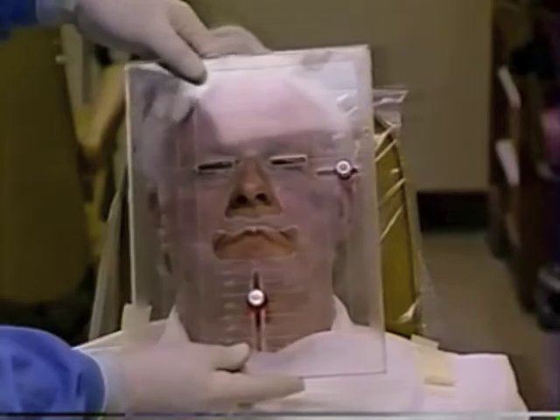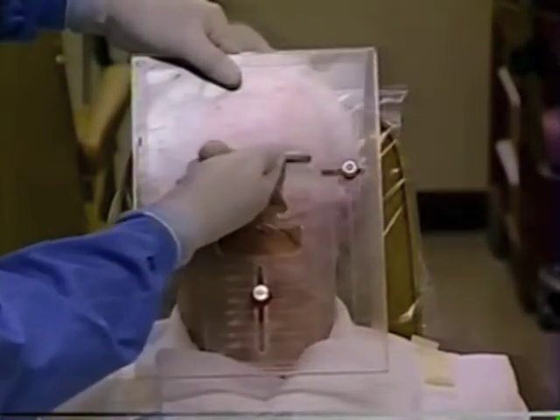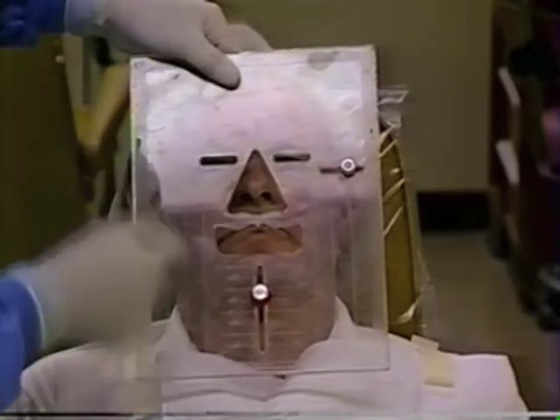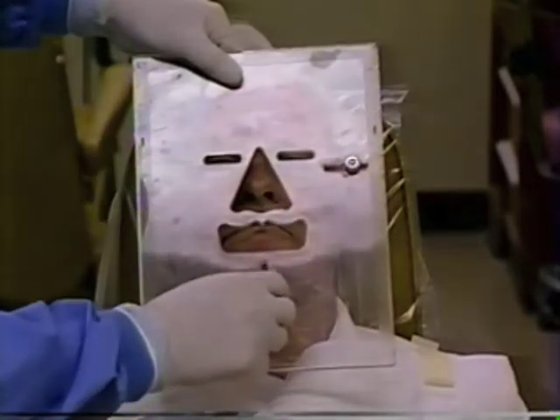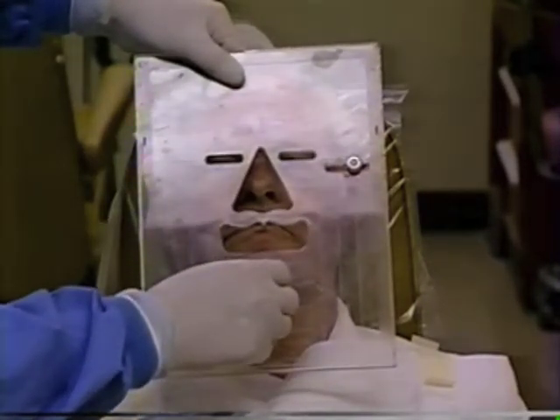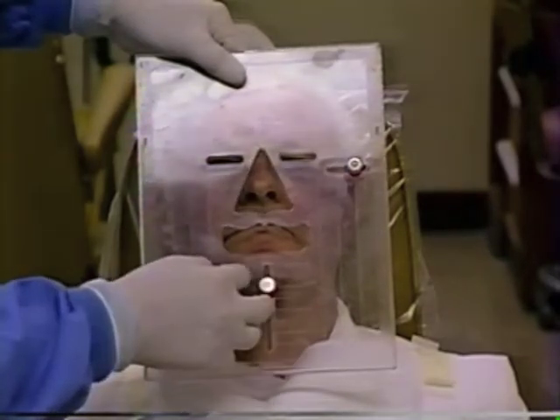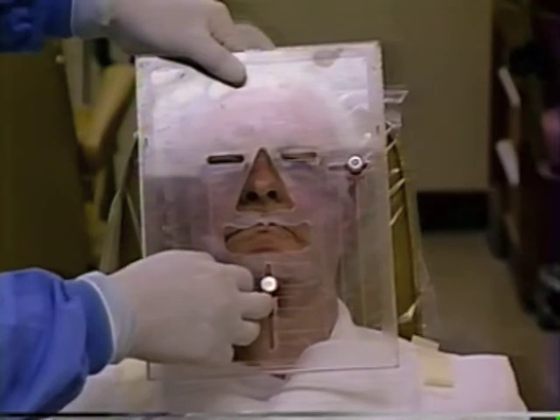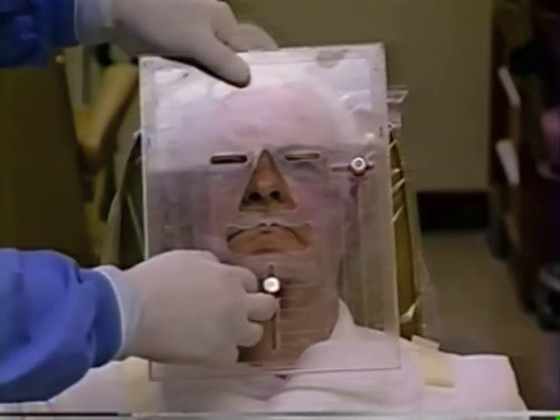We can do that with a gadget the manufacturer furnishes that gives us automatically that size. We place the nose into this part and the pupils of the eyes running right through this line. Moving the lower portion up to touch the bottom of the chin, the top edge of this gadget will show the length of a central incisor — in this case ten and one-half millimeters.